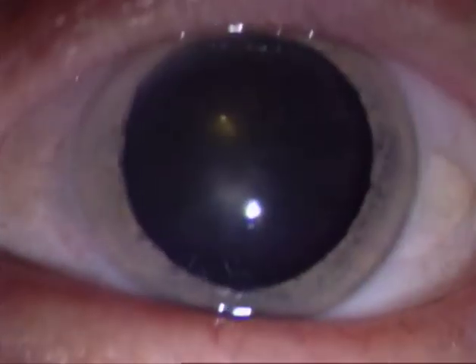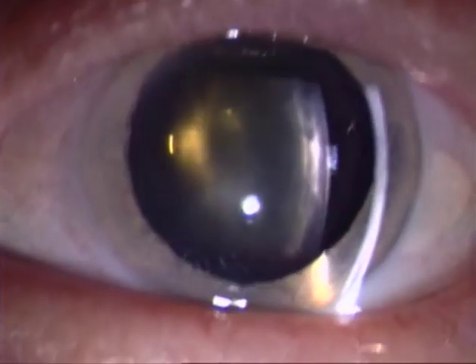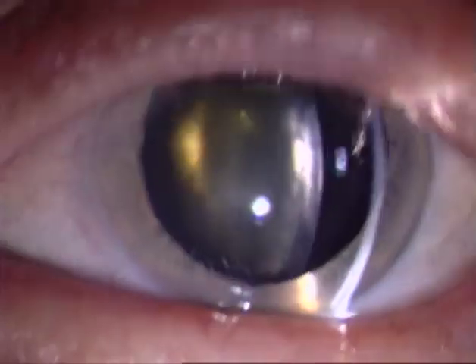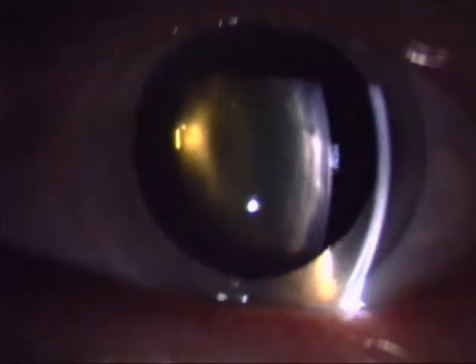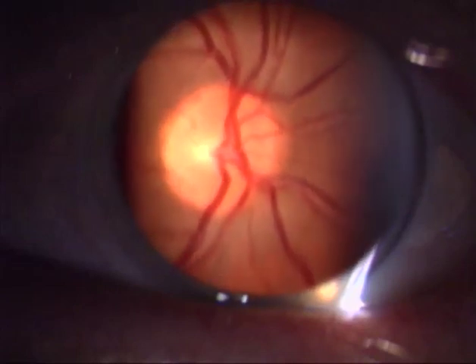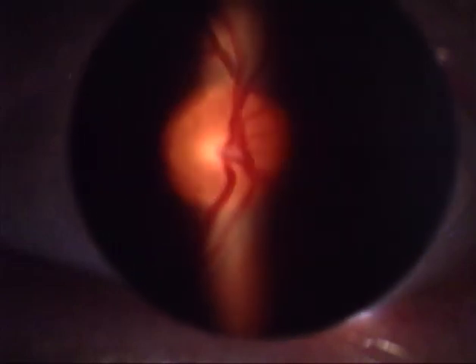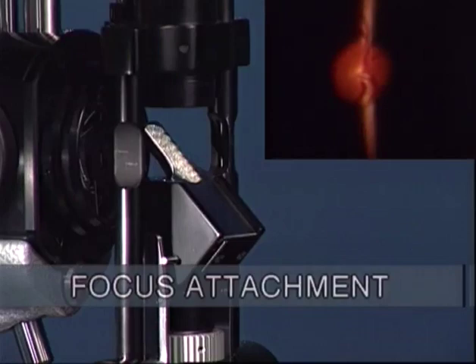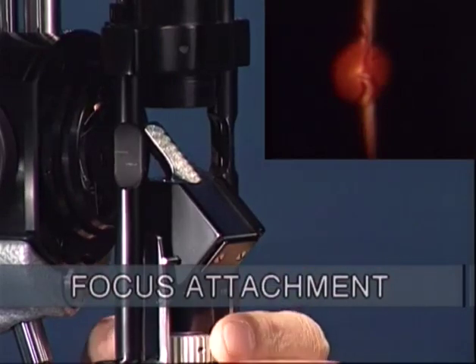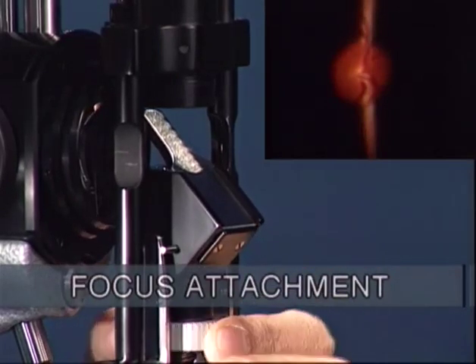The coincidence of focus is effective, however, only in air, and precision remains still satisfactory only in the anterior segment of the eye. But during the examination of the deep parts of the eye, coincidence of focus may be lost, so that the slit light appears blurred. In order to sharpen the light again, that is to re-establish coincidence of focus, the focal length of the slit light must be adjusted. This is done with the focus attachment, which changes the position and angle of the mirror from the clicked-in 0 position.